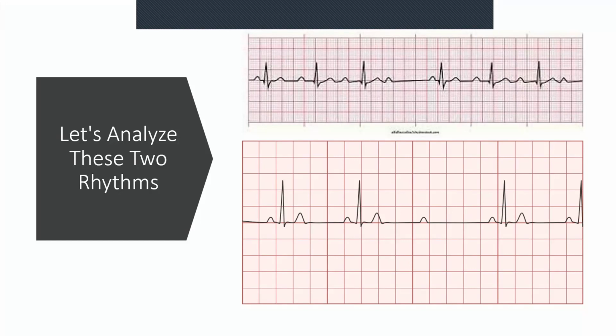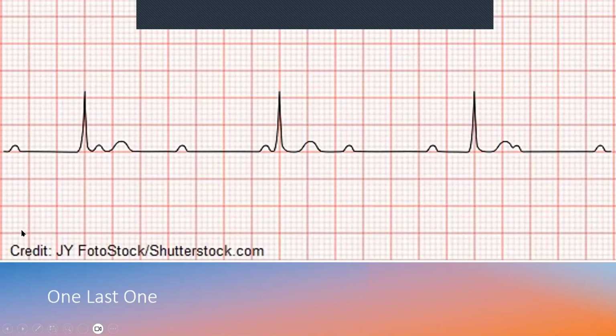The PR is getting longer, Mobitz type 1. Okay. Mobitz type 2, PR is long, and drops. Long, and drops. And type 3, grade 3 or complete heart block, there's no relation between the atrium and the ventricle. Now, the one other way to remember it, normally the QRS complexes are wide, all right?